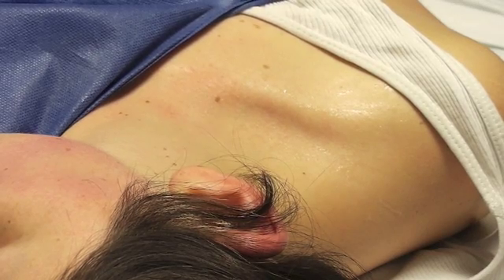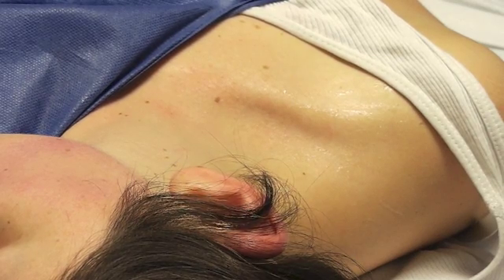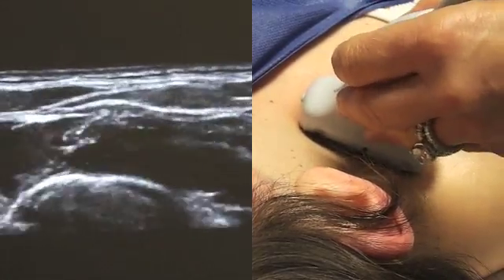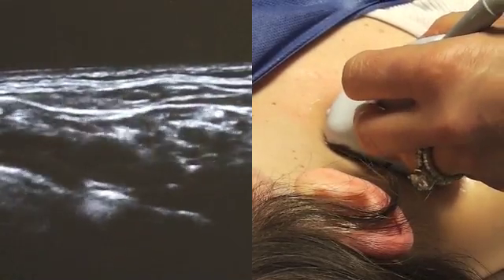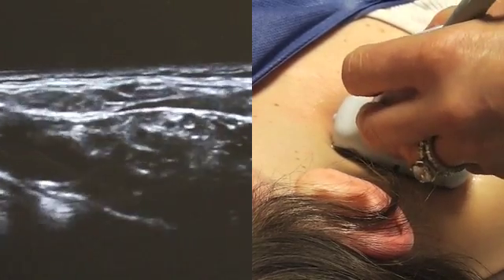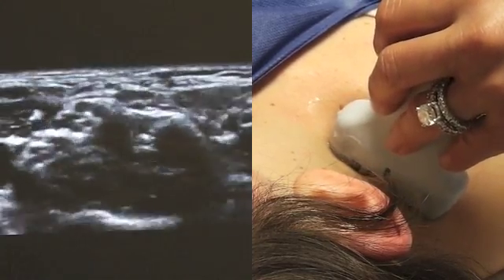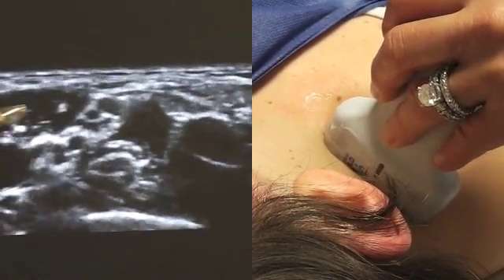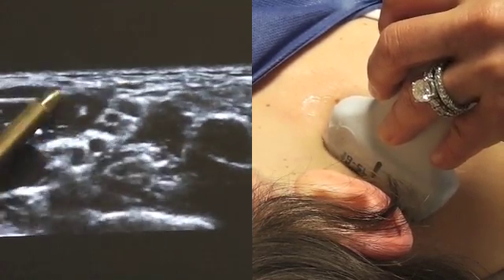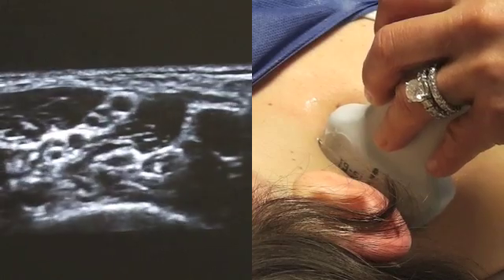For an interscalene block or catheter, we place the patient in the supine position with their arm adjacent to their side. We turn their head away from the side of the block. The first thing we always do is identify the plexus in the supraclavicular view. This is our home base — it's very reliable and always a great place to start, and a great place to return to if you get lost when looking for your interscalene groove. We slowly rotate the probe in a cephalad direction until the interscalene groove comes into view, and you see the two bellies of the anterior scalene to the left and the medial scalene to the right. That's a very nice picture in this model.